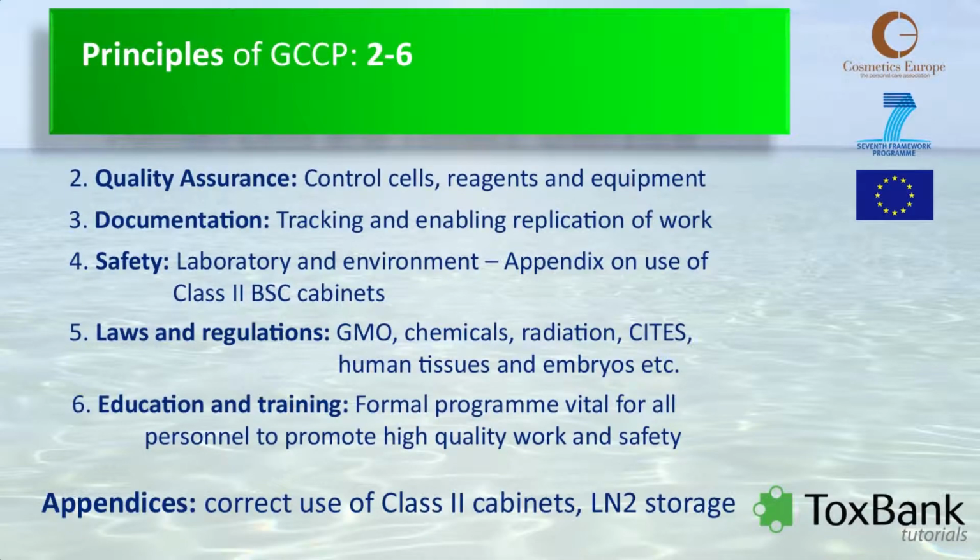And there are also laws and regulations on the use of human tissues and embryos, and the CITES International Agreement on use of cells and tissues from endangered species. These laws and regulations given in the 2005 publication may have been updated since then, so it's worthwhile checking your local conditions from a regulatory and legal perspective.